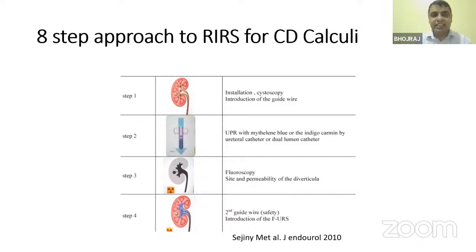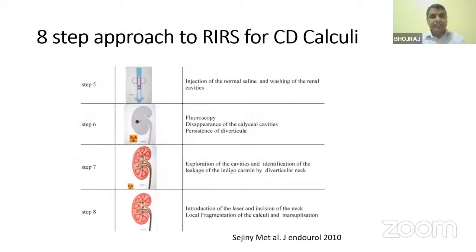Professor Traxler's team has given an 8-step approach for RIRS for CD calculi. Basic ideas, again, I have highlighted that: URS, guide wire application, then indigo carmine or methylene blue instillation, fluoroscopy, safety guide wire. We are not using the safety guide wire that often.